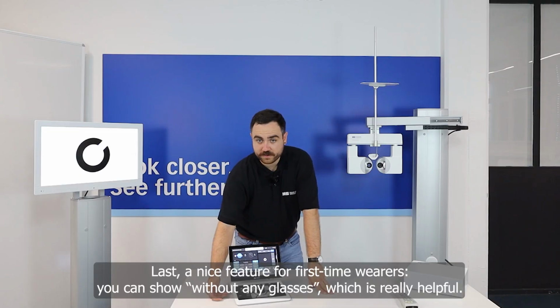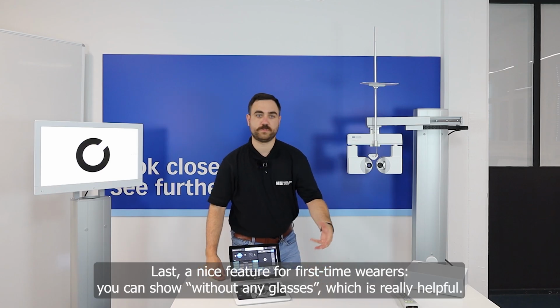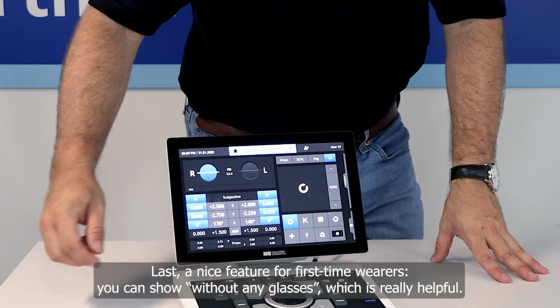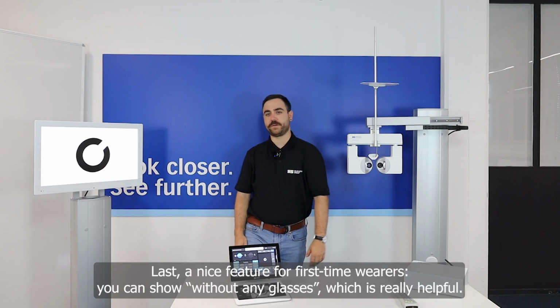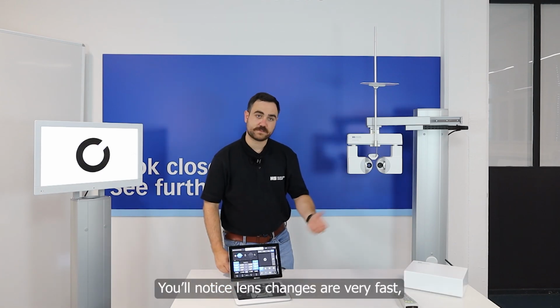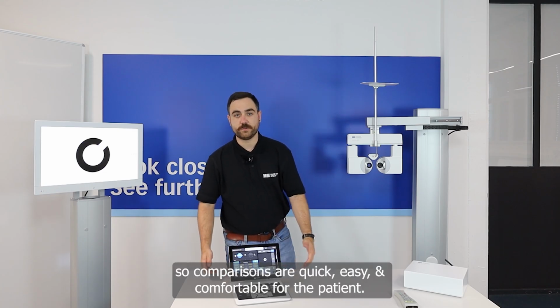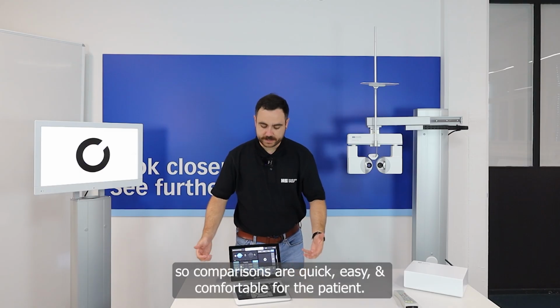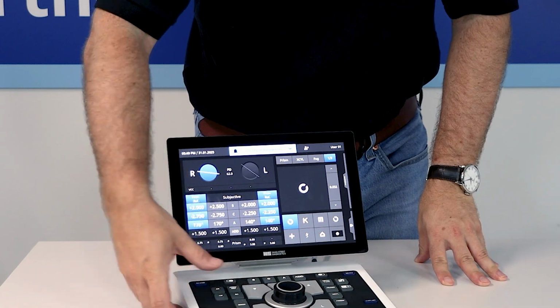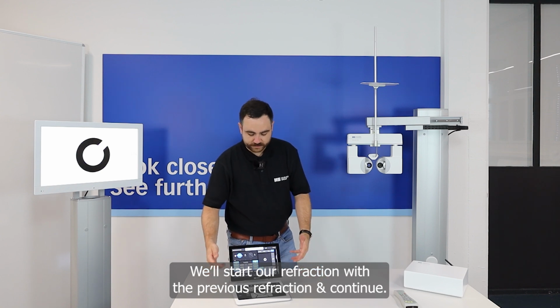And last but not least, what is really nice, if that is a new customer who never had glasses before, you can also show, hey, that's without any glasses, and it's a really nice function. You see the lens exchange is really fast, so the comparison is really, really easy, and a nice thing for the patient. So we will start our refraction with the previous refraction and go ahead.